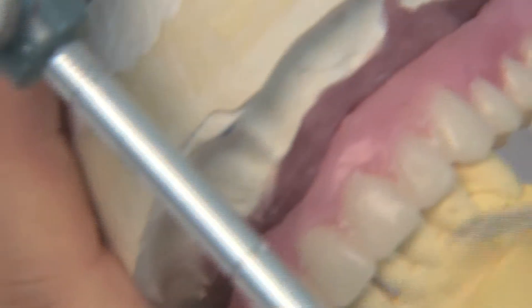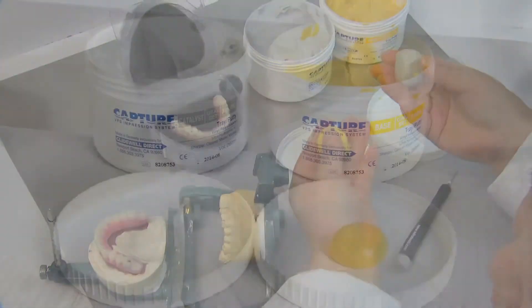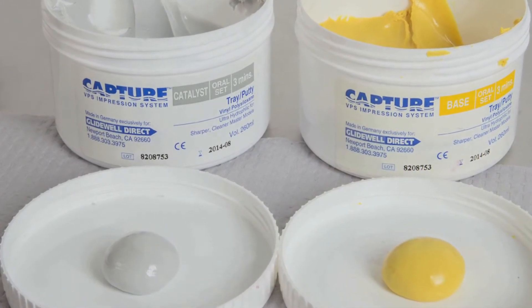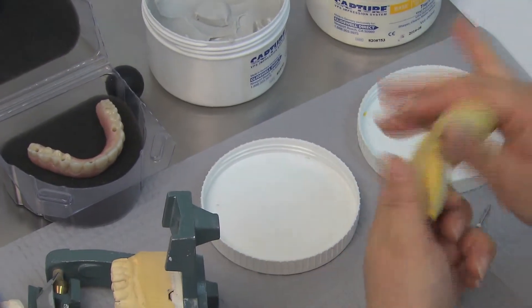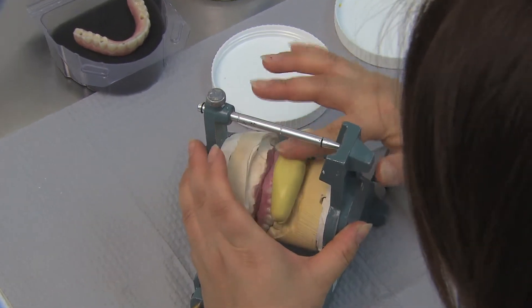The technician uses equal parts capture vinyl polysiloxane base material, seen in yellow, and capture vinyl polysiloxane catalyst material, seen in gray, and kneads them together until it reaches a consistent color. The putty is then rolled into a cylindrical shape and pressed against the facial side of the closed working model toward the opposing model.